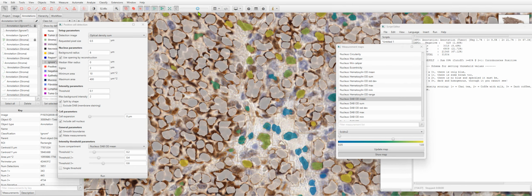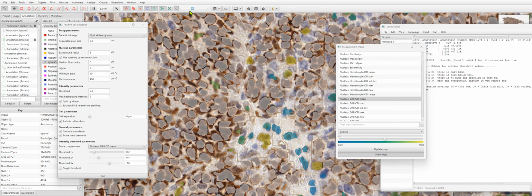Let's take a look again. Oh, there's one up here that's still a 3+ range. And when we pop that one out of existence, we're at about 0.88. So I set my threshold for 3+ at 0.88. All right, I have my threshold for 3+.